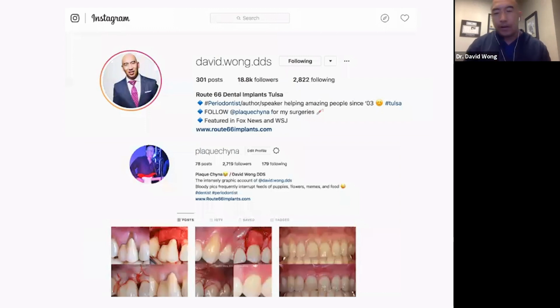And then another thing is called a Benex root extractor. So if you ever break off a tooth and you have nothing but the root left and you don't want to drill it out, look up the Benex root extractor. It's spelled B-E-N-E-X root extractor. But those are the things that I keep in my office all the time.